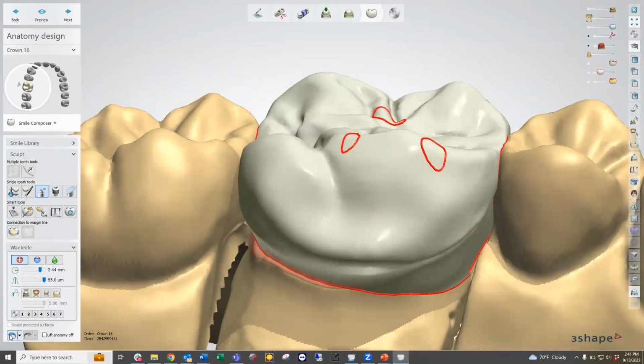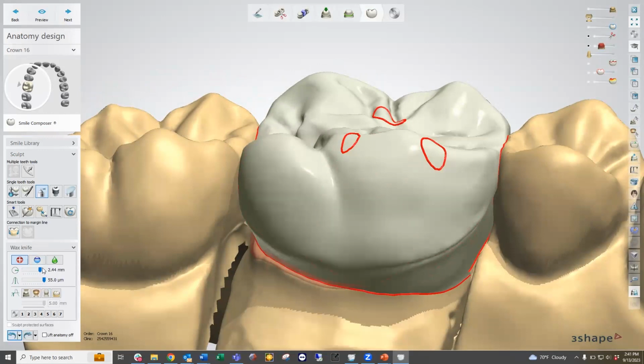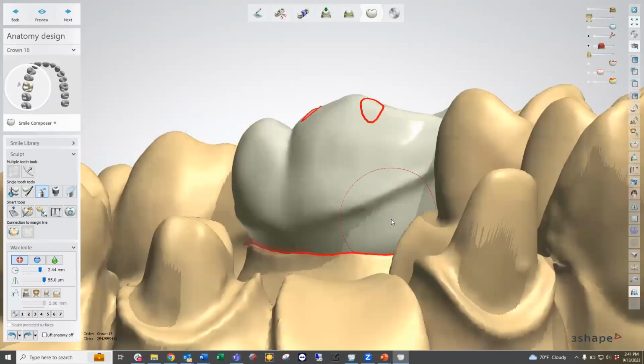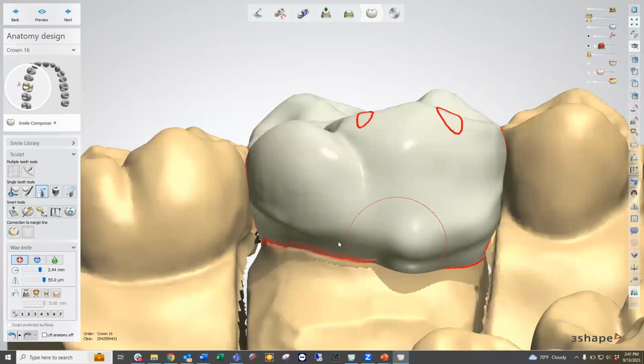Okay. And again, the area of influence is going to be more dictated by this circle size, and it's going to be more intense towards the center of the circle and gradiate out. So it's going to add more towards the center and gradiate out. Okay. Now we can go ahead and get crazy with this one. So you have to be careful with this. We have to add a little bit where we need to.